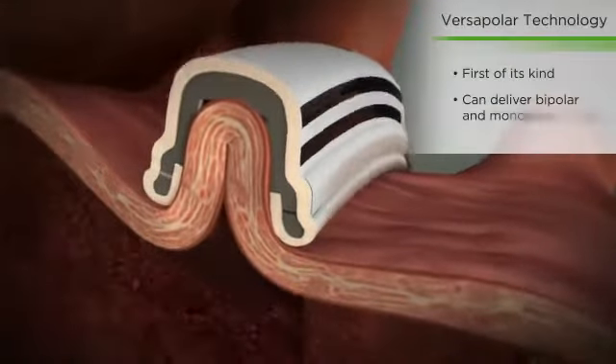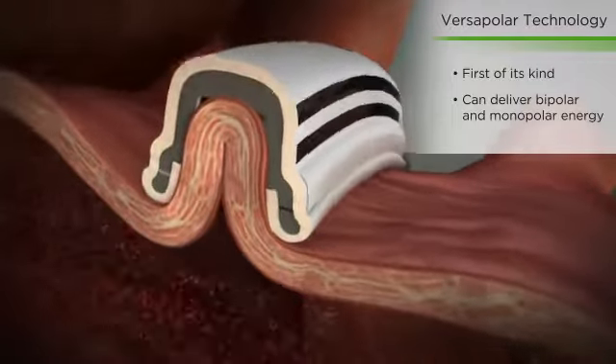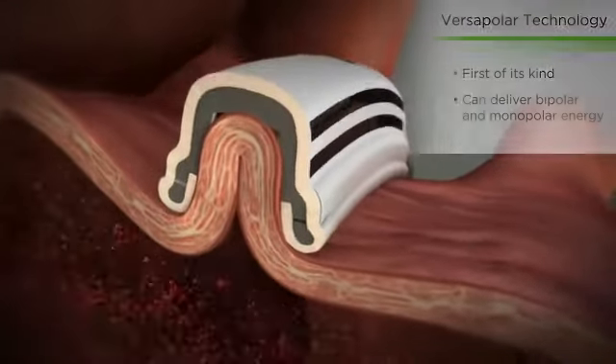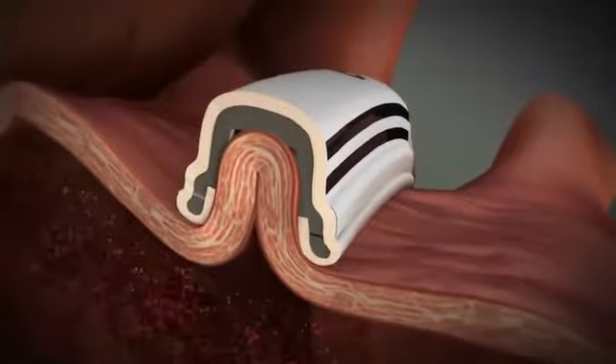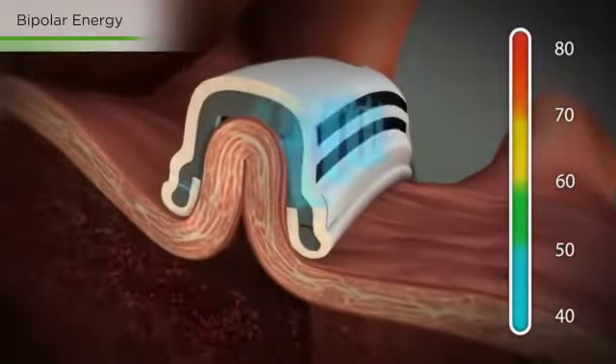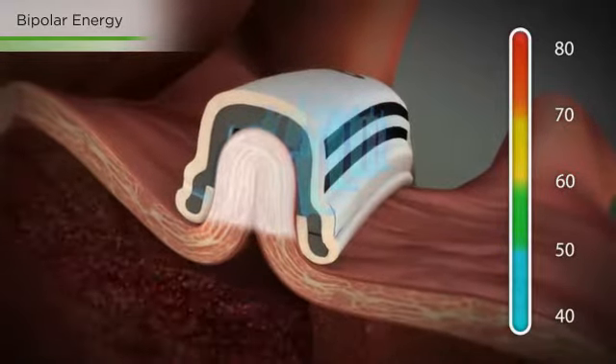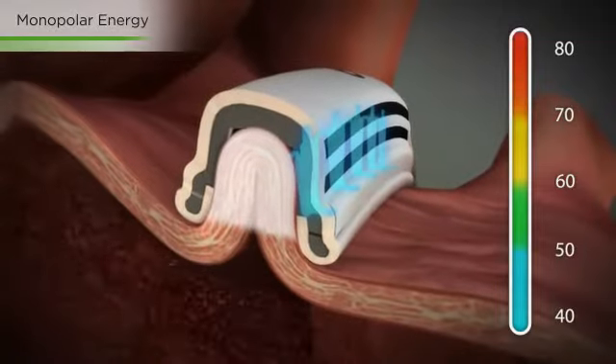The COBRA fusion combines patented temperature-controlled radio frequency powered by proprietary versipolar technology. To begin ablation, the electrodes are activated. Bipolar ablation is done first, followed by monopolar ablation.